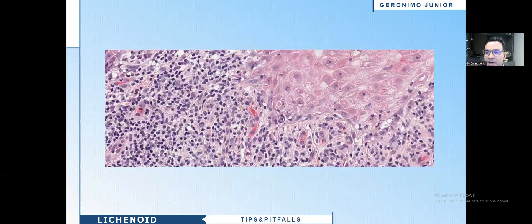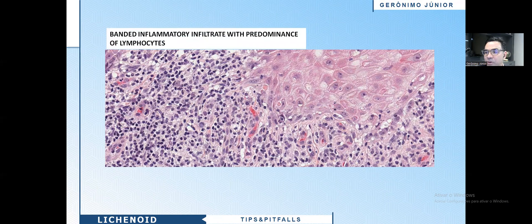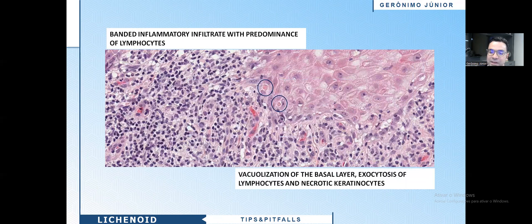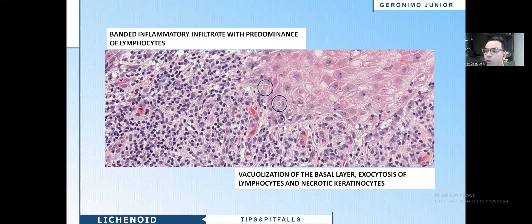At higher magnification, we see a dense, intense inflammatory infiltrate with predominance of lymphocytes. There is vacuolization of basal cells, and we see many necrotic keratinocytes. So you are facing a lichenoid dermatitis with clinical and morphological features compatible with lichen planus. That is my diagnosis.